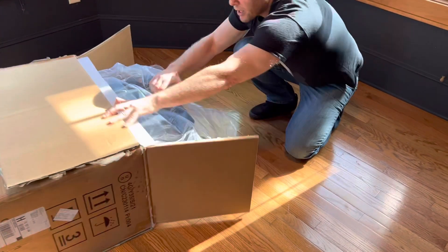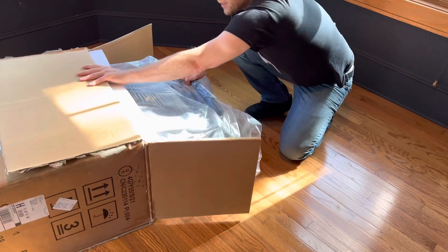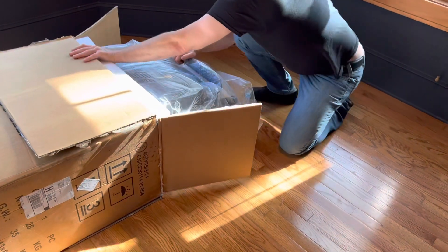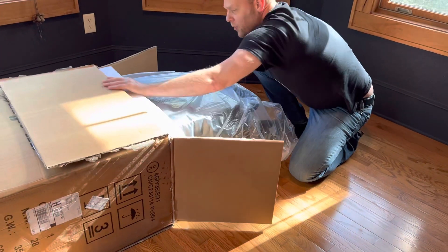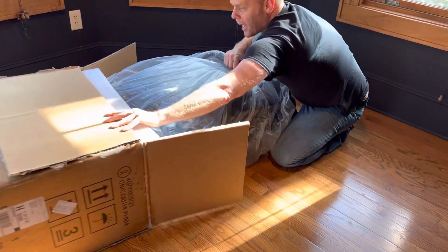I'm just kind of scooching it out here, grabbing the top handle, easing it out. I'm getting more and more excited by the second because this is the first 2022 model that I've actually had my hands on, and we're still in the beginning of 2022.